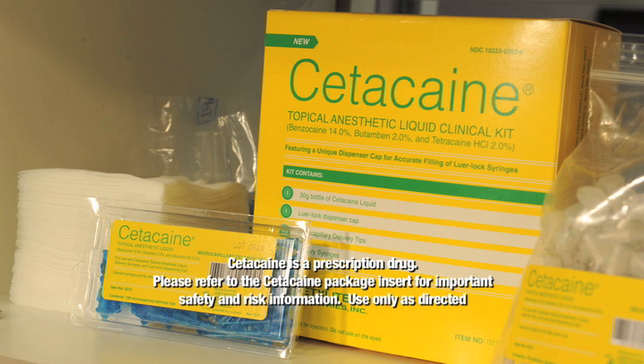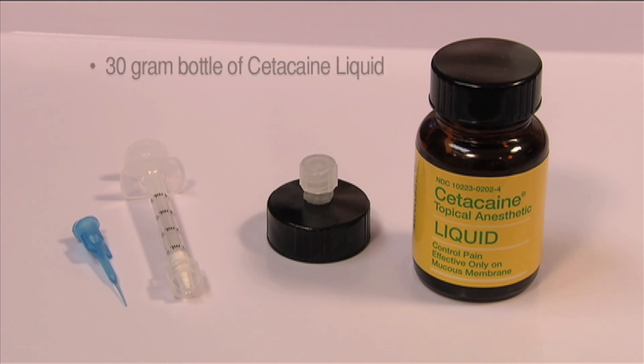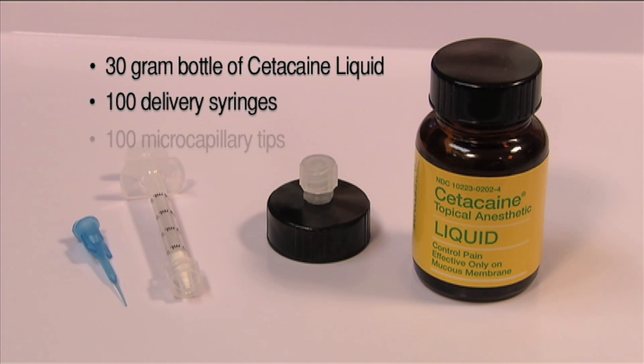The Cetacane liquid clinical kit facilitates the subgingival delivery of Cetacane liquid topical anesthetic. Components of the kit include a 30-gram bottle of Cetacane liquid, 100 delivery syringes, and 100 microcapillary tips.